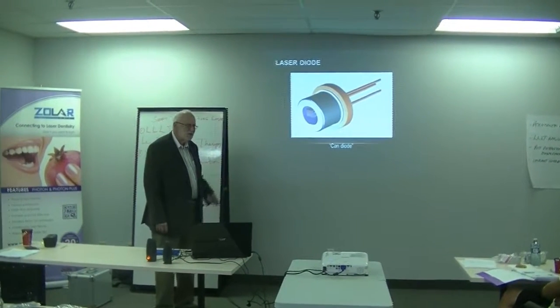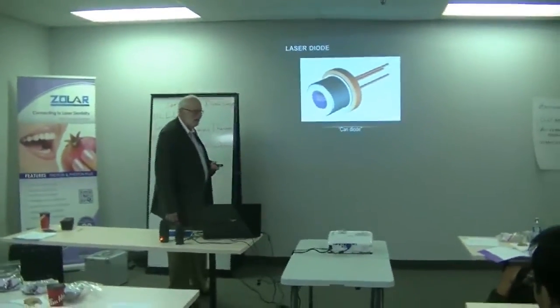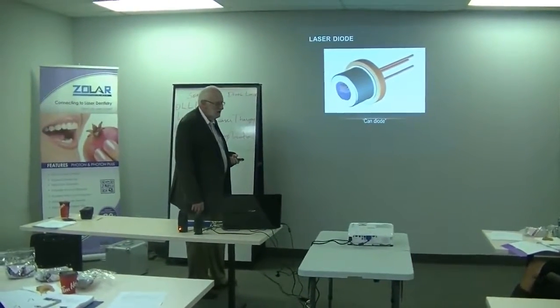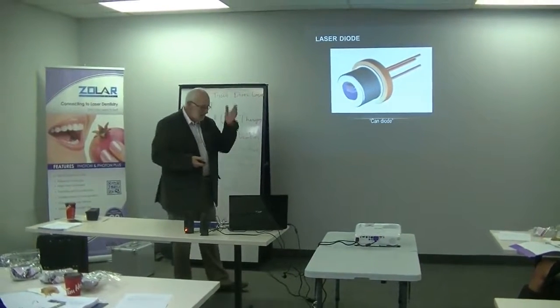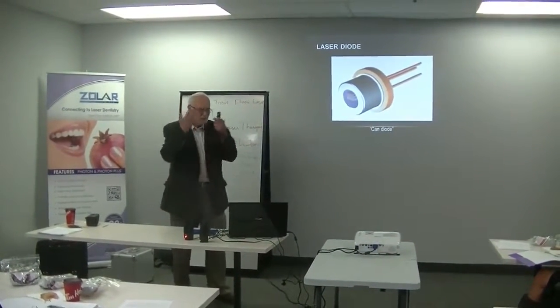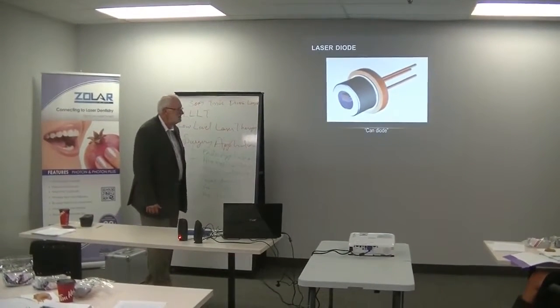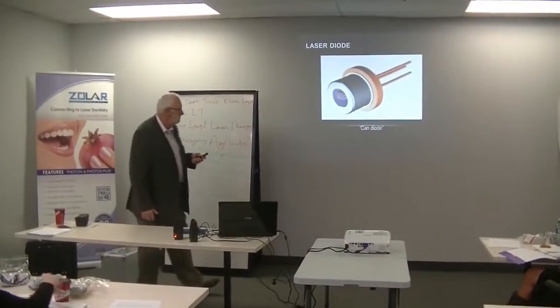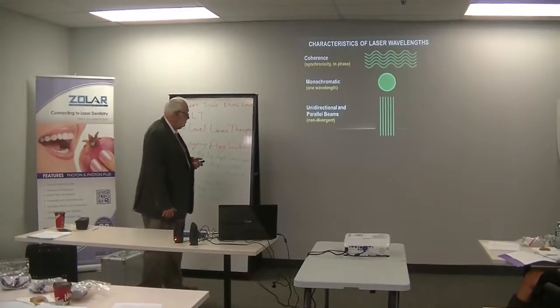feet high, weighs about 250 pounds, compared to the diodes now that are so small, and that's what changed dentistry. It was when the diodes came out small, because basically lasers sort of took off in the 90s, and then they dropped off quite a bit. Then diodes came along, and everything's picked up again. So now I think probably around 25% of the dental offices have lasers now, from the last statistics I read. So light is light.